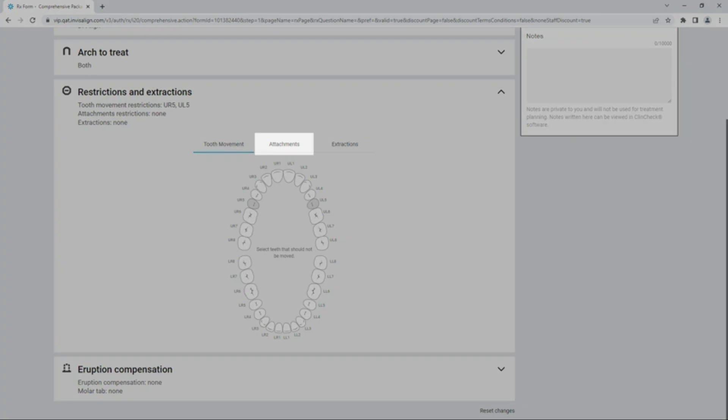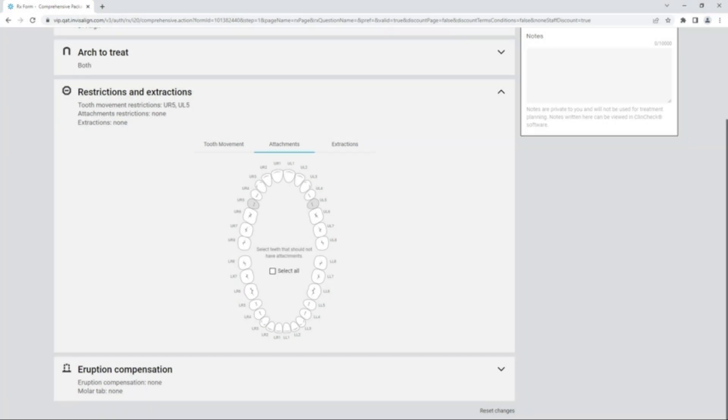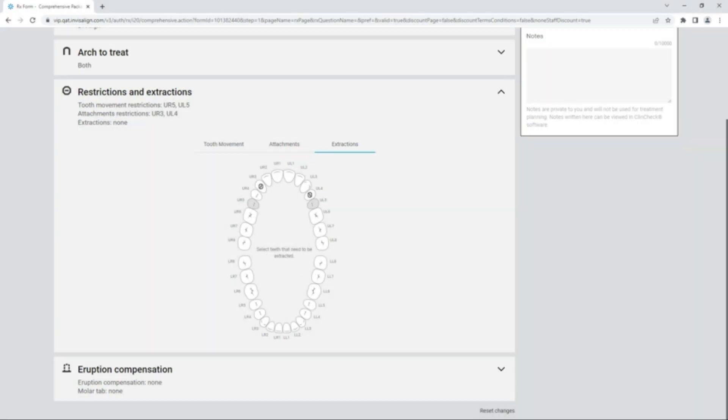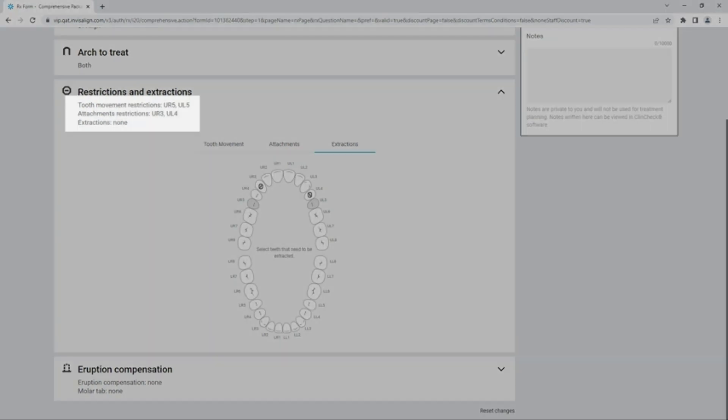Next, by hovering over and clicking on Attachments, you may select teeth that should not have attachments applied. For example, Upper Right 3 and Upper Left 4. Our last tab is the Extraction tab, in which you will select teeth to be extracted. Please note that you can see that the two previous selections have carried forward and can be seen under the Restriction and Extractions section.